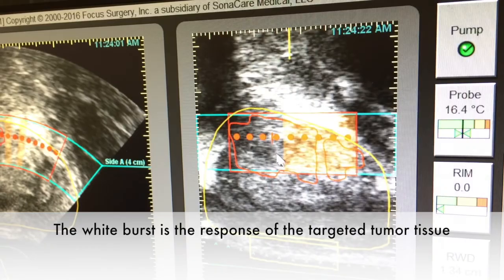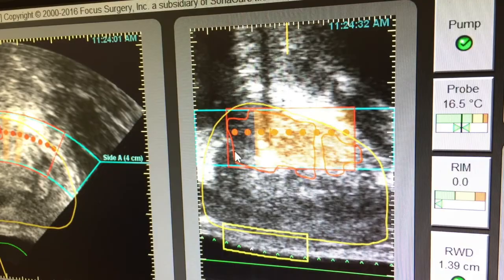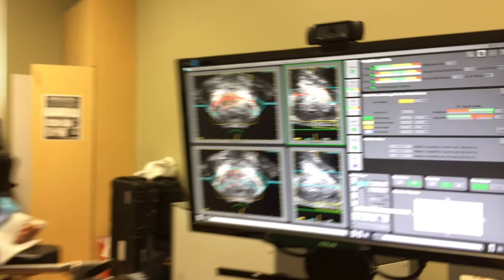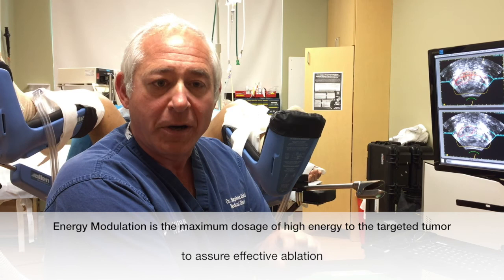The coloring is a feature of the Sonoblate software called Tissue Change Monitoring. The orange coloration tells us there's been a very significant and effective delivery of energy to this tumor. This technique allows us to ensure that we've delivered the appropriate amount of energy over the tumor. In the next phase, we'll show you how we overlap energy onto the tumor to effectively increase the energy dosage to the most significant portion of the tumor — a critical aspect of the MRI mapped energy modulating technique.